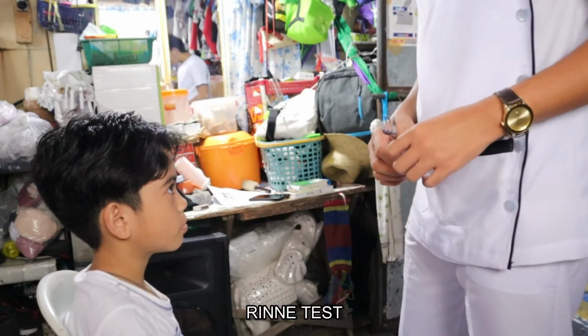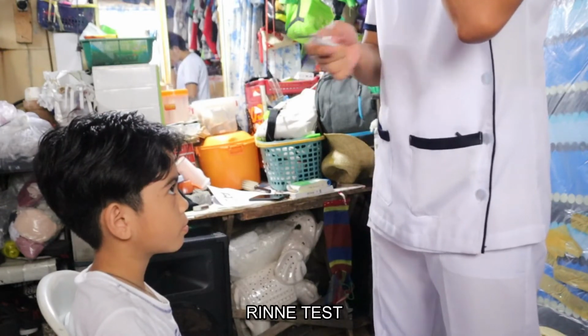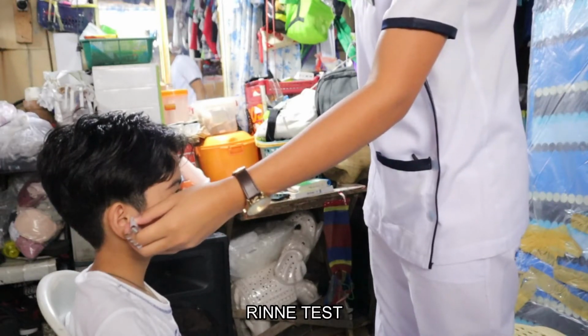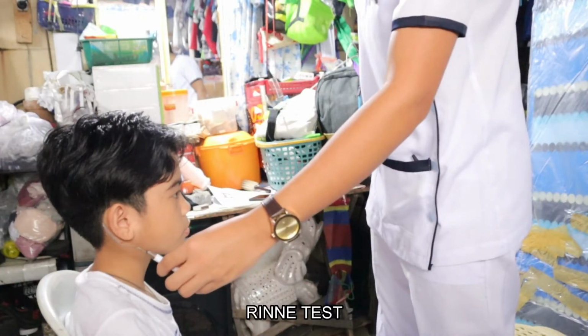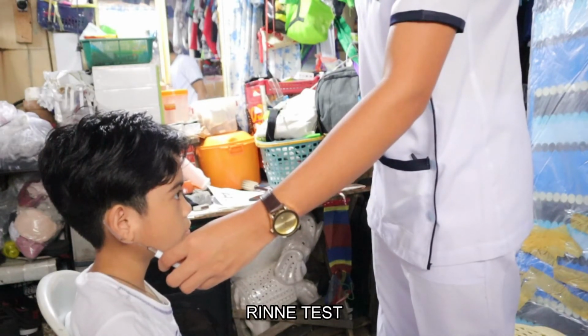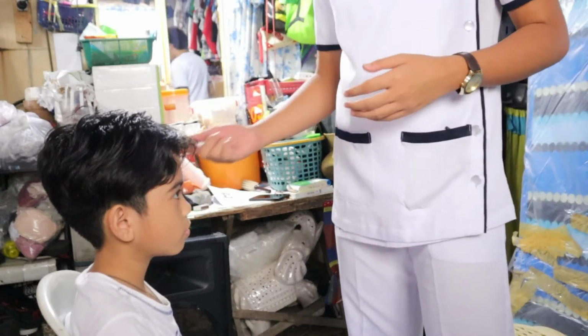Now, in Rinne's test, hit again the tuning fork on your elbow in order for it to produce a sound wave, and place the tines on the mastoid process. And put it this way, and tell the patient to raise their hand if the sound stops, and do this again on the other side.